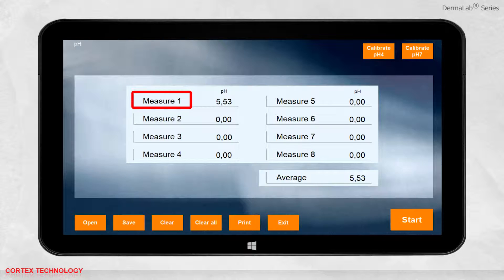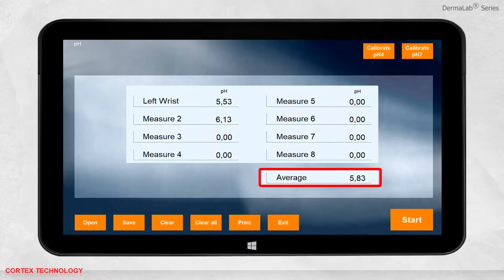You can change the name of each measurement. When you take multiple measurements, the average result will be calculated. As always, you can save, print, or open previously saved data.